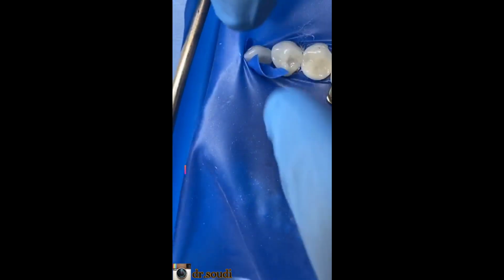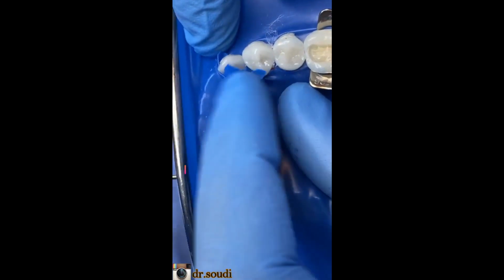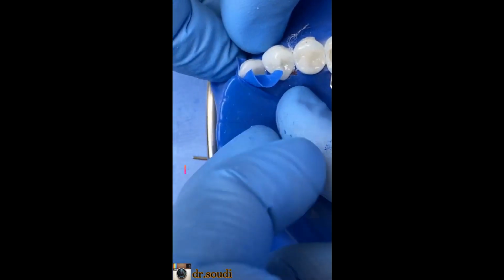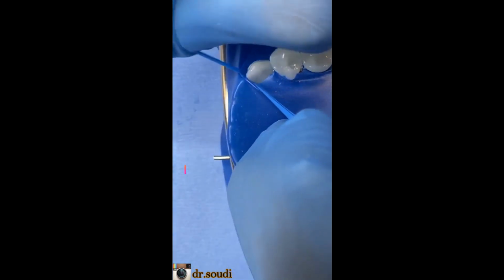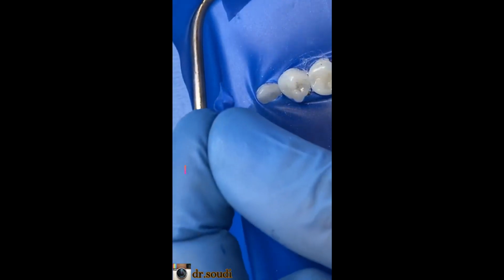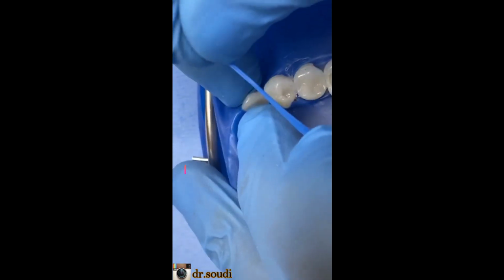If I'm working here, I'm not worried about there being a leakage here. There was no leakage here. Okay, this is the trick. If I need to remove it, the way I insert it, I stretch it and elevate it. Okay, like this, it's out. If I need to insert it again, in Arabic.